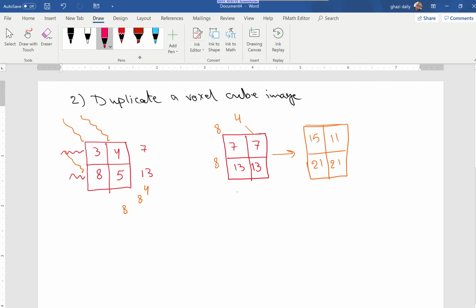Stage number 3, we radiate from above, and this will result in a new number taken by the detectors that are 9 and 11. Now again, placing the 9 and 11 there and adding them, we get 20, 9 and 21, 30, 11 and 15, that's 26, 11 and 21, that's 32.